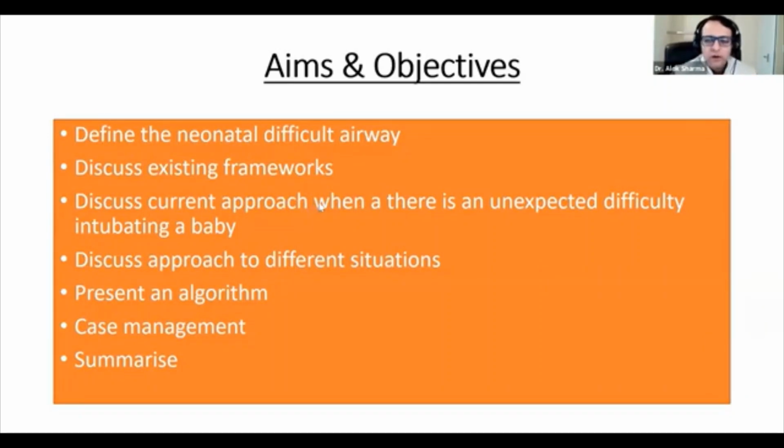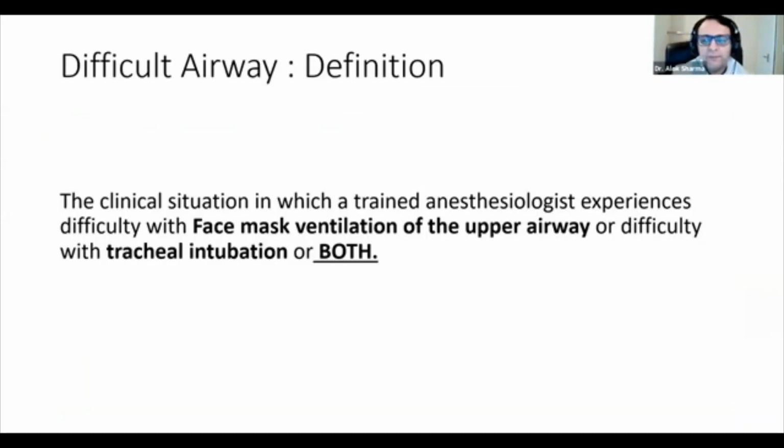We will then talk about a case, and at the end, I will summarize how you can develop a difficult airway algorithm for your own local setup, even if you don't have the high-tech gadgetry. To be honest with you, you don't need it. But in some situations, obviously, being able to use a video laryngoscope is something that I am extremely passionate about. Both me and Justin, who will be speaking to you after this, have a special interest in video laryngoscopy in the management of the neonatal airway.